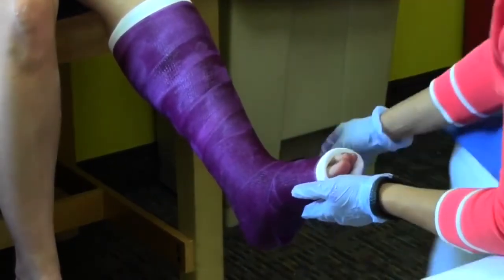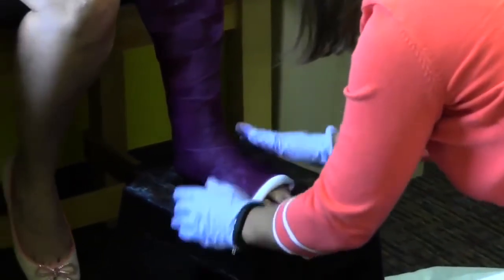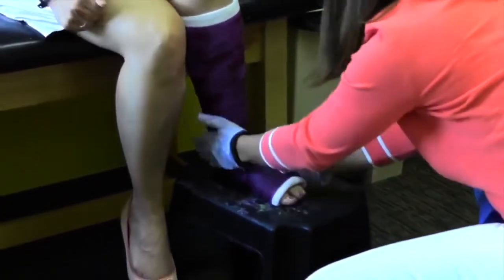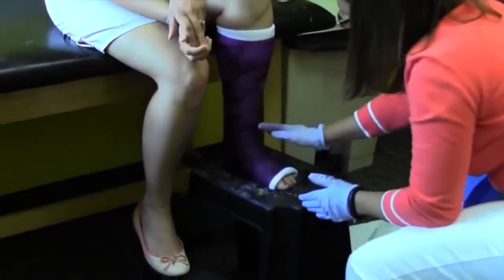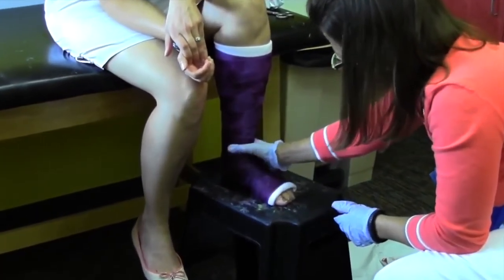If you do happen to have a step stool like this handy, you can put the foot down on it, scooch out a little bit. You want to keep the foot flat so that they have a nice walking surface. This will make a nice walking cast for her.